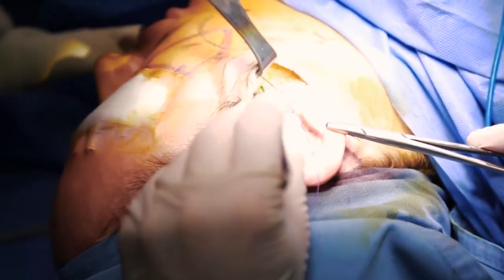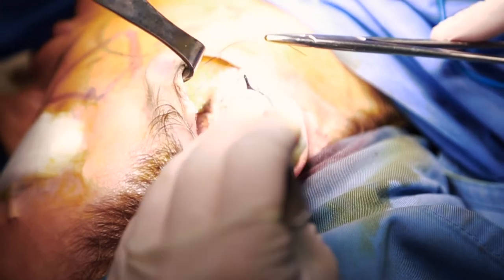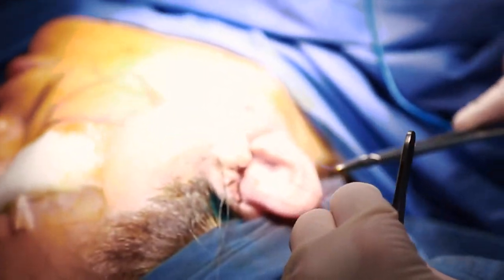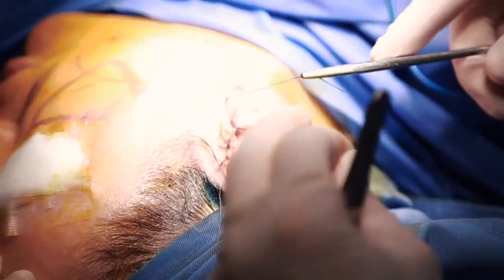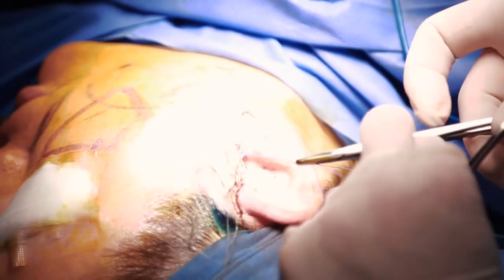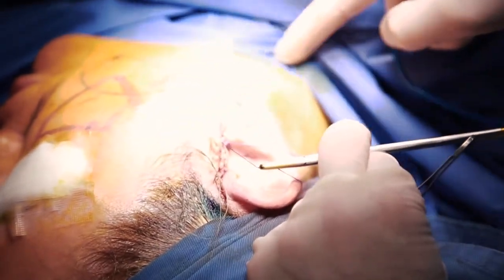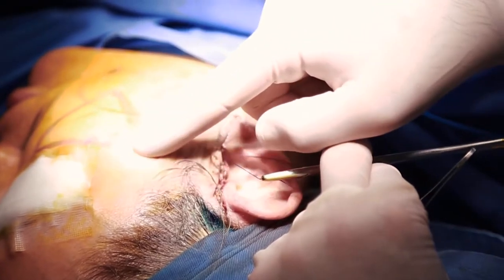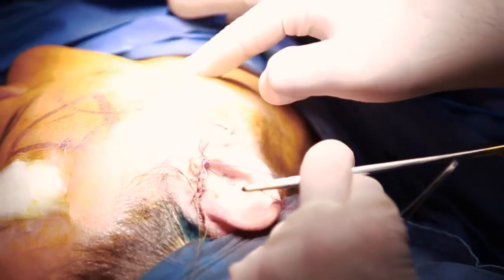What we have done is elevated the skin flaps and we have the underlying muscle — this is called the SMAS muscle. It is really important to address and lift that because it is the underlying architecture of the face. I have just placed the first suture there, and you can see as I pull that suture it pulls the entire face tighter. I am going to do a line of those from just above the mid-face all the way down into the upper part of the neck. That will give us our mid-face lift, our jawline tightening, and our neck lift.